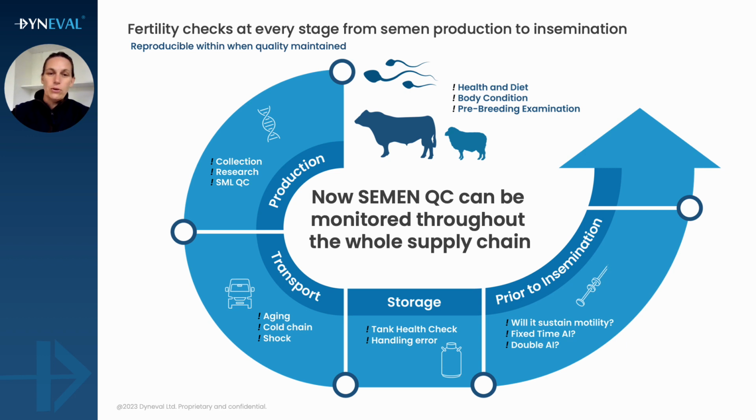This allows everyone to check the quality and the longevity of semen motility, and we expect the results should differ no more than 5% if the cold chain has remained intact. With this information, you can now identify any challenges or issues that may arise causing deterioration.